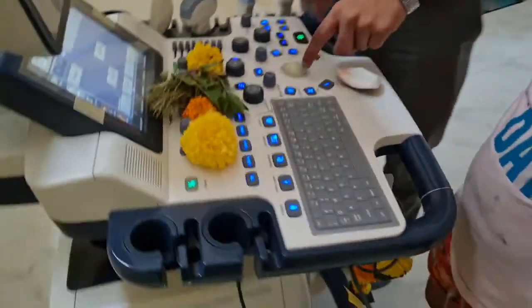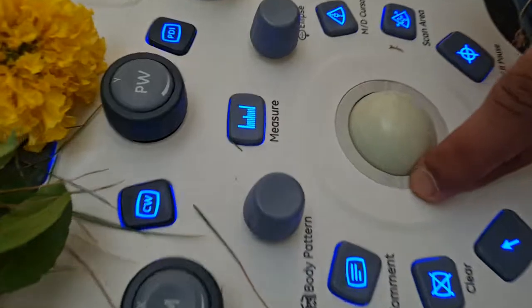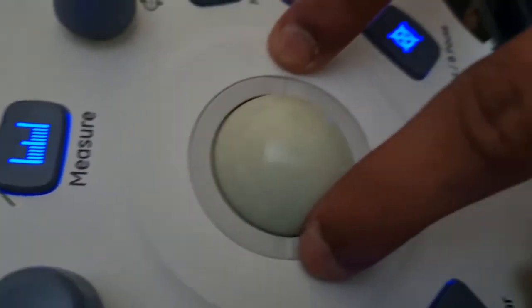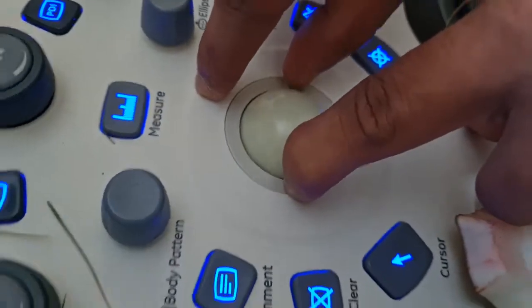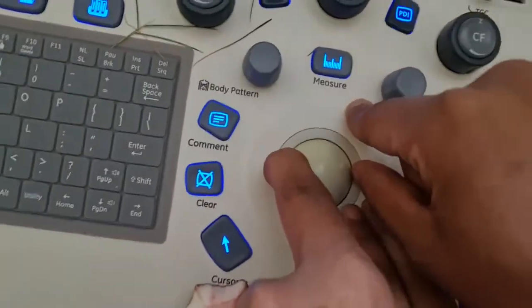So these 2 slots are here, this and this. While removing it, on the left side we have to push it down, and from the right hand side, you have to push it upside.